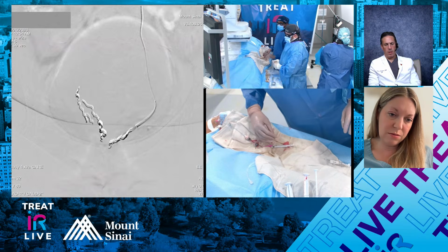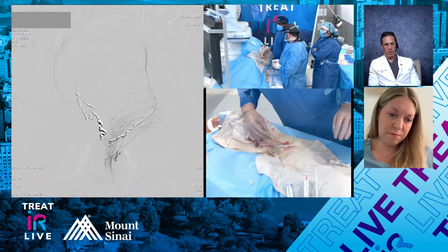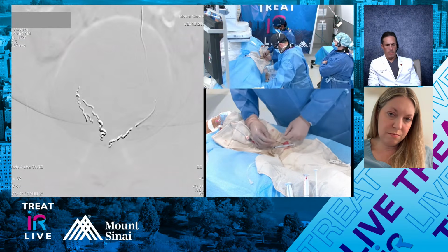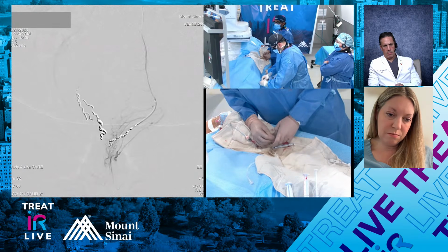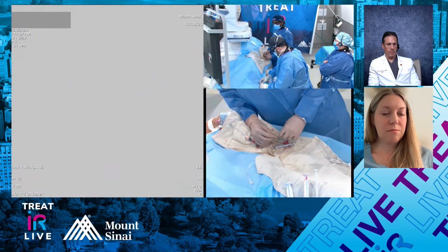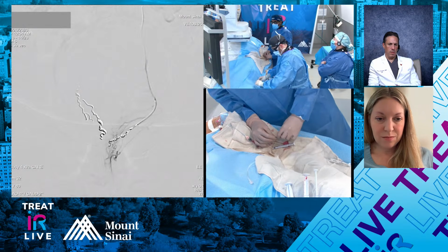You can see the middle rectal at the end there. Is your suspicion that this is going to be the end, or do you think there'll be more vessels? My suspicion is that there'll probably be one more that popped up, but we'll definitely take a look, coming from the other branch. That's great.